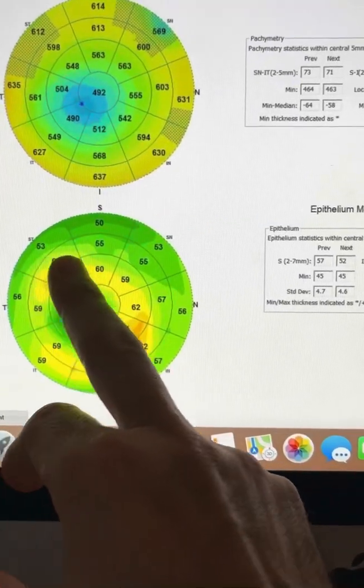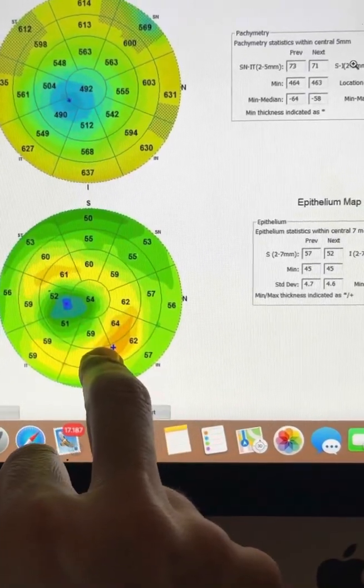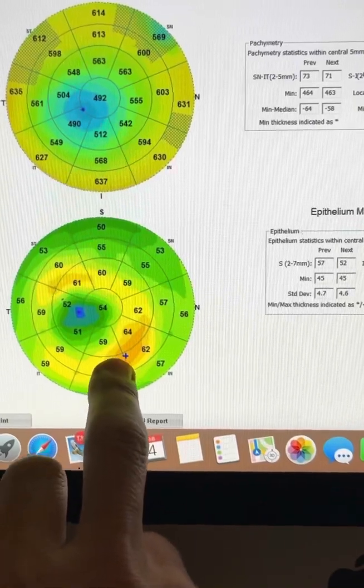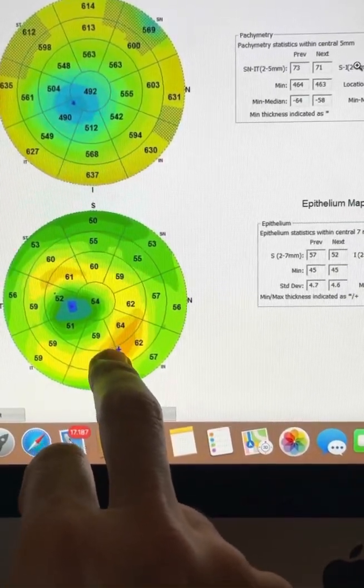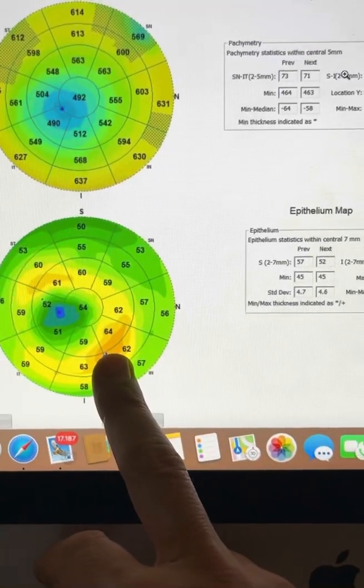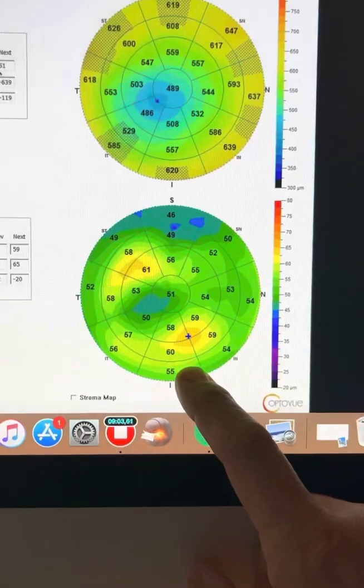And also, the epithelium around the cone has become significantly thicker with the thickest epithelium measurement at 65 microns here and here to try and cover up the cone. The same measurements today look a much milder epithelial response.